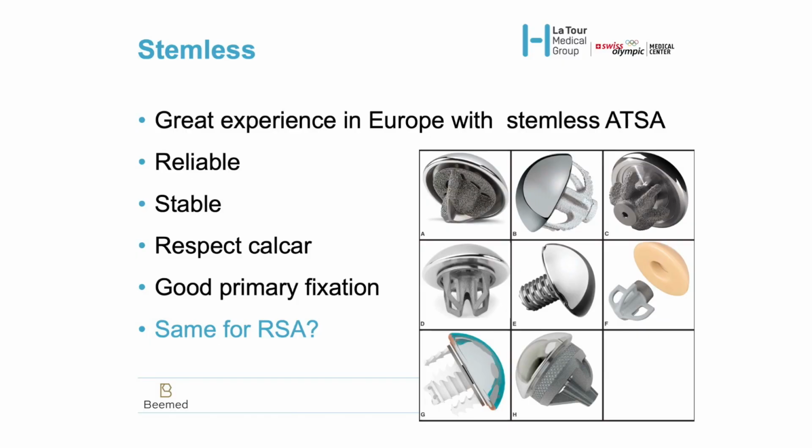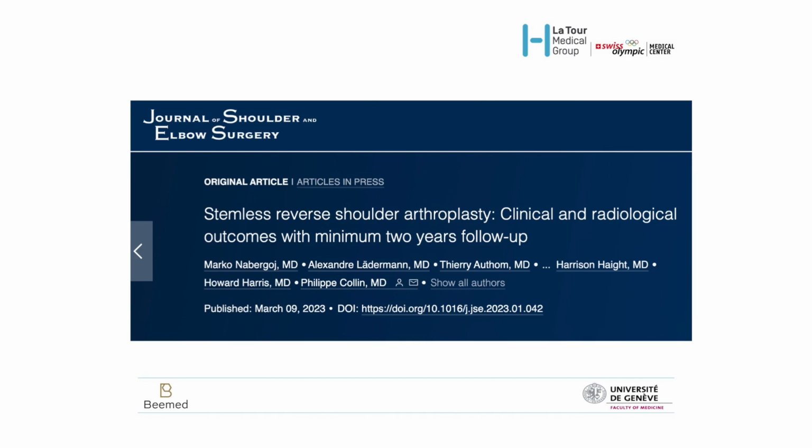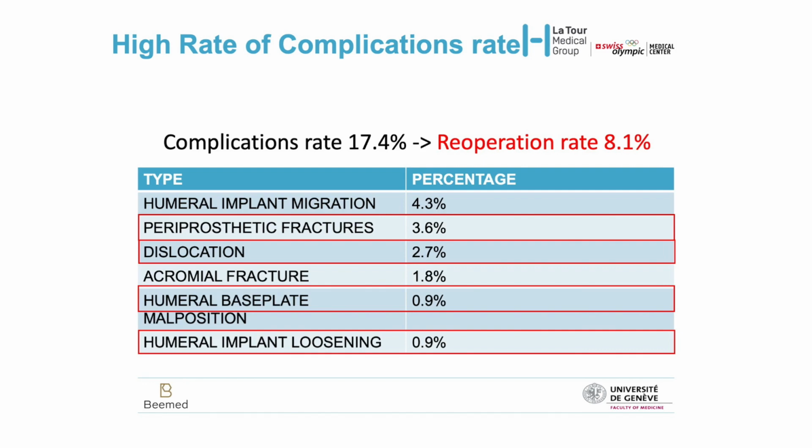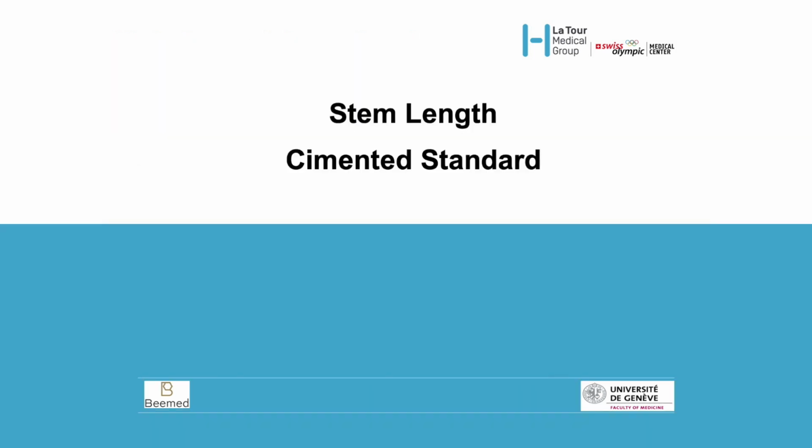And what about the stemless? So the stemless in Europe, we have a great experience for anatomic with honestly very good results. But we don't know yet if it's the same for the reverse. And please read this article that just has been published by Philippe. It's a multicentric study analyzing one design, the FX Solutions one, with peg fixation, only design. And the result, I wouldn't say that they are alarming, but it's clearly not satisfactory, with quite a high rate of complication, high rate of reoperation, and most of these reoperations concern the humeral component. For me, clearly today, for the reverse, we haven't found the solution. I know that Mathys is working on this topic, and they will come with a great inlay prosthesis soon. But today, I would be very worried and I personally stopped using this kind of device.